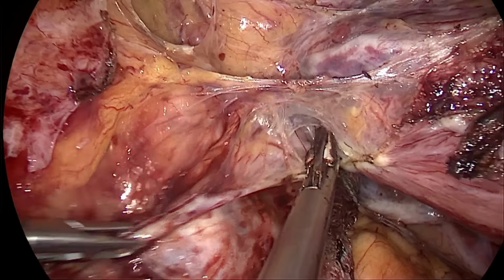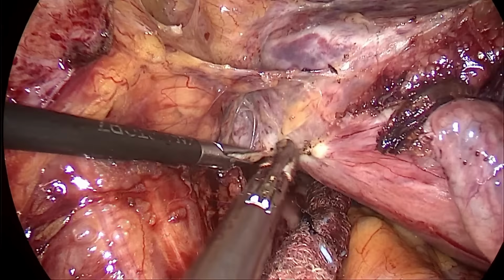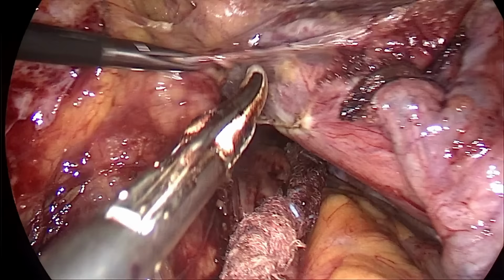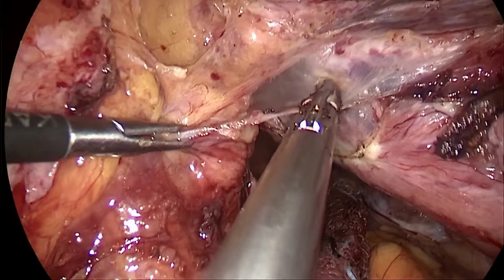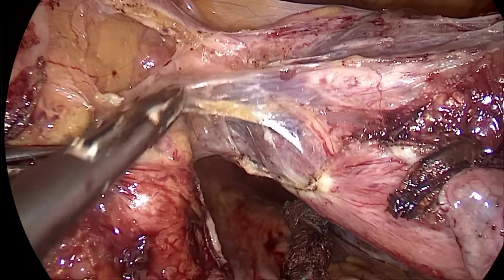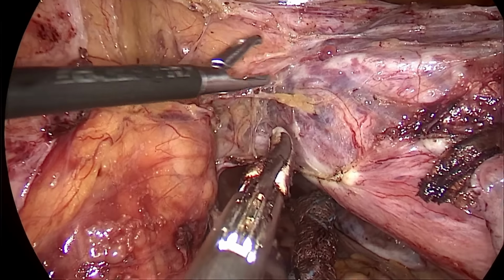So I will take that peritoneum along with my specimen. That's my ureter, just below my grasper. So you have to be away from that. So just above my ligature is the uterine artery, you can clearly identify.